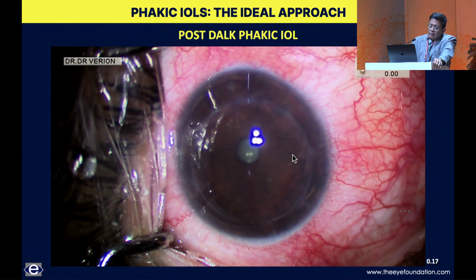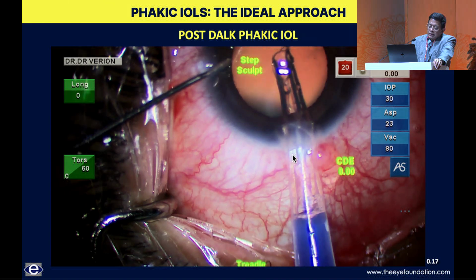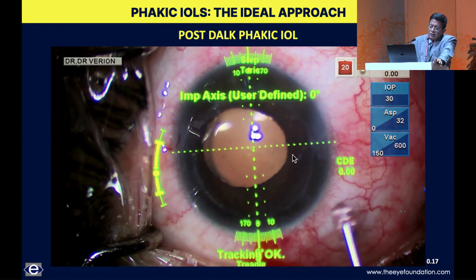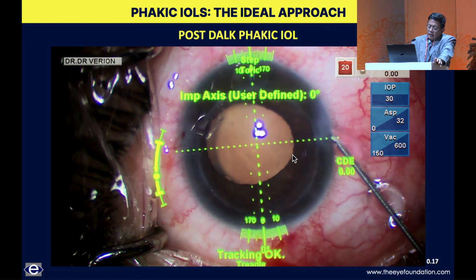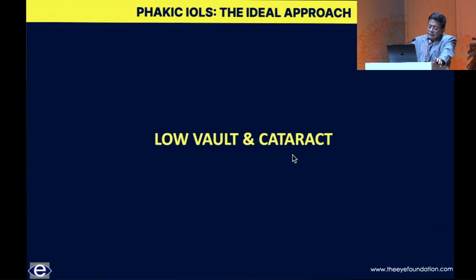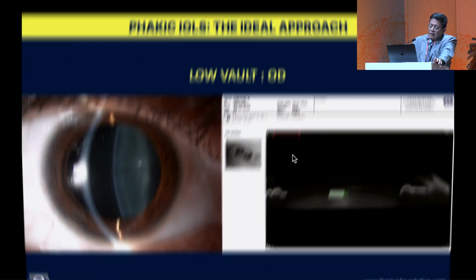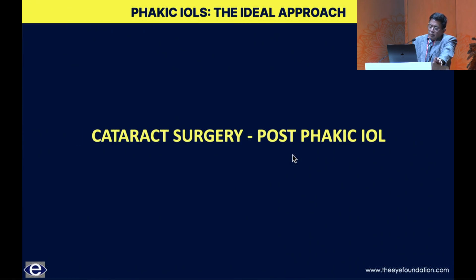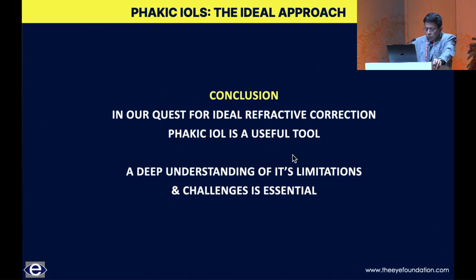post-corneal transplant. We have to conclude. Yeah, especially you have to be cognizant of the fact that there should be minimal damage to the endothelium. So use a good amount of endothelial protection also, and go ahead and implant these lenses. And low vault and cataract, just because there is low vault, if the anterior capsule is quite clear, then we do not go ahead and do anything about it. I'll skip this video about cataract surgery post-ICL.